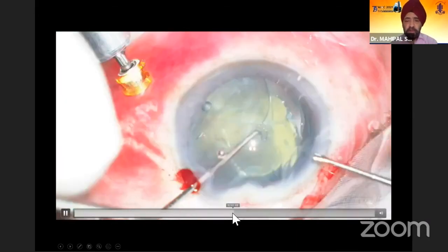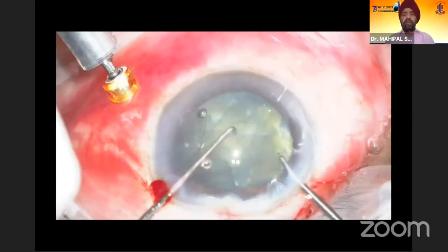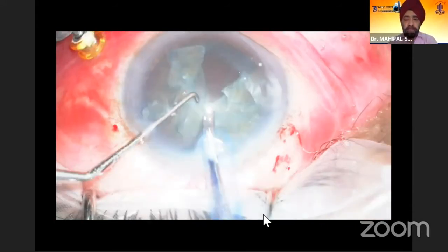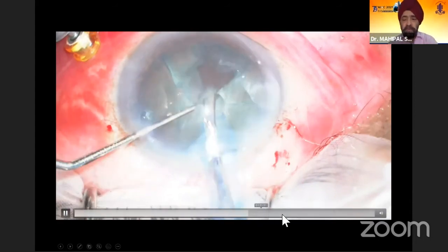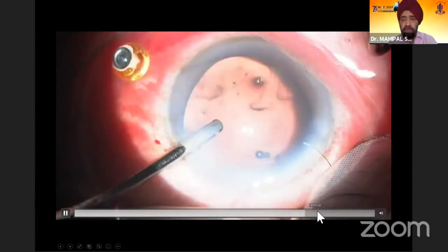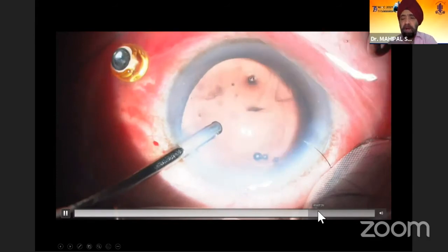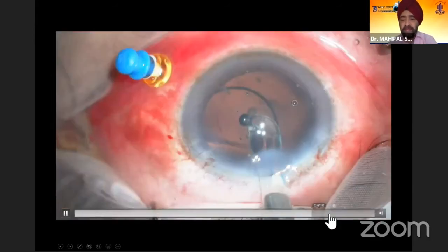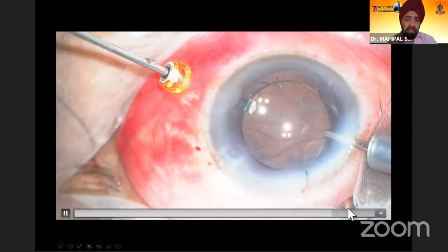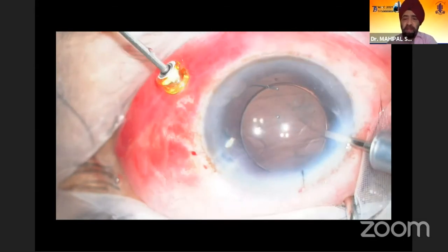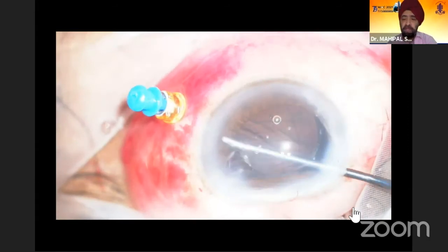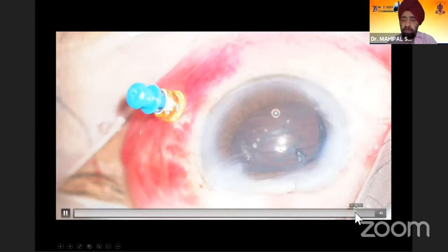After vitreous decompression, a pure endocapsular ring is placed since it was a traumatic subluxation not expected to progress. The nucleus is removed, epinucleus removed bimanually, viscoelastic placed to prevent the capsular bag from coming forward, and a three-piece lens is implanted. Remaining vitreous is removed from the anterior approach. Vitreous decompression using a posterior approach is very important whenever you have subluxations. This is the post-op result.